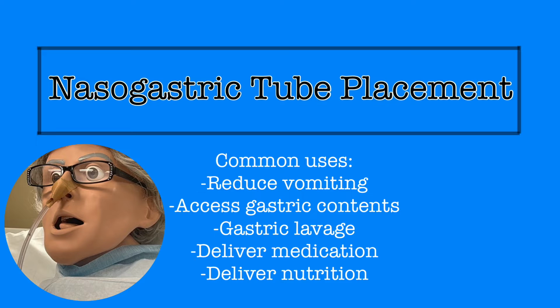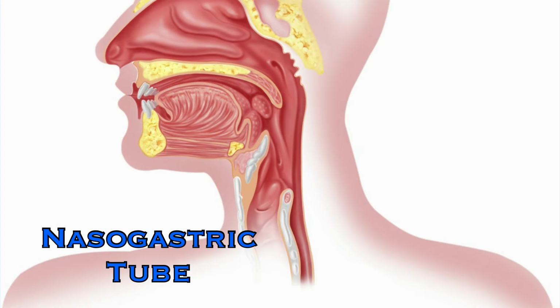Troubleshooting and tips and tricks are better demonstrated on a real person, and you can view this in a separate video where I try them all to successfully place an NG tube on myself. This video will focus on the required steps to successful placement of an NG tube. Let's start with the basics.